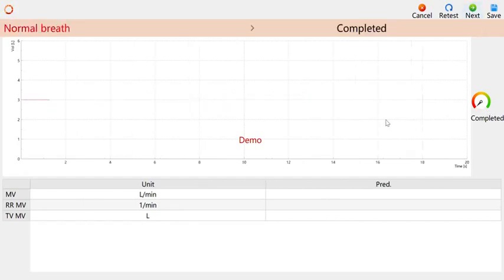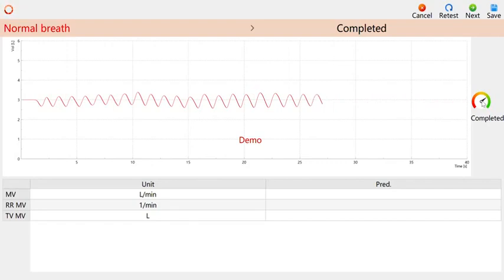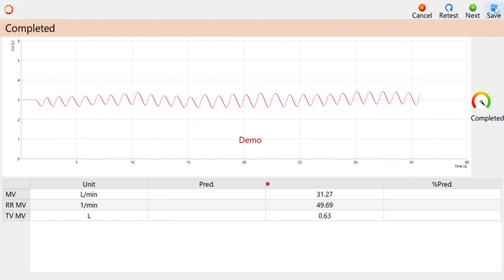It shows that the test is completed. Click Next to conduct the second test, and repeat the first test process. The pointer on the right represents the 30-second countdown. When the pointer turns full, the countdown ends and the test is completed. Click Next to continue the test. Click Save to finish the test.